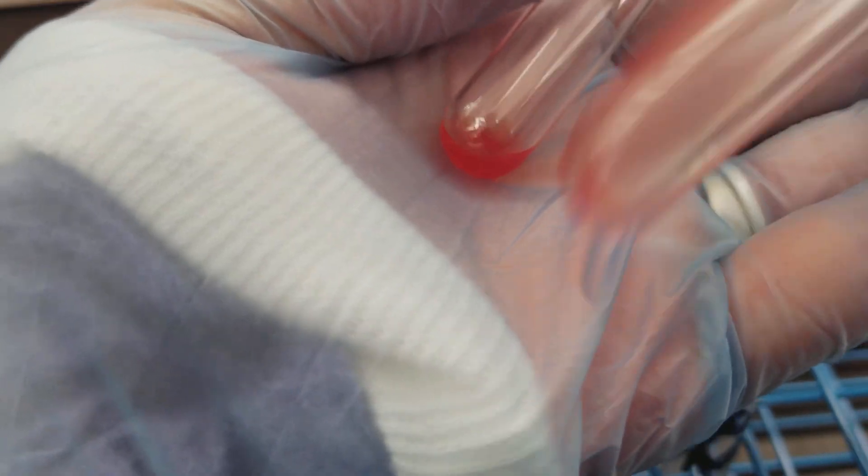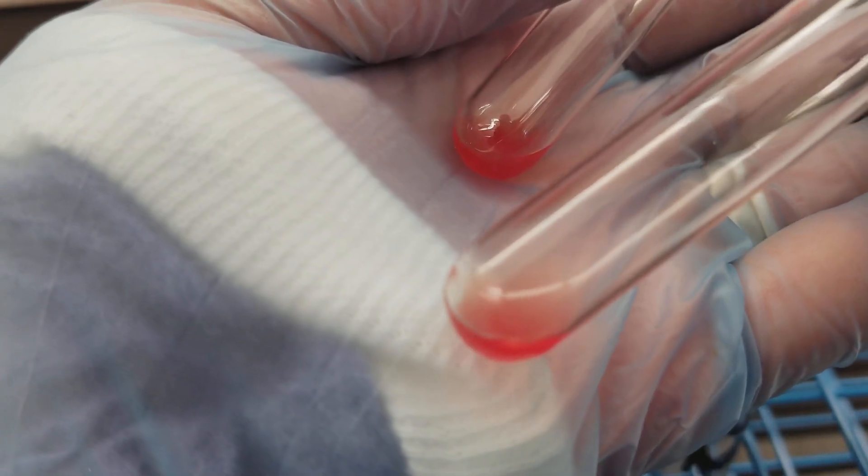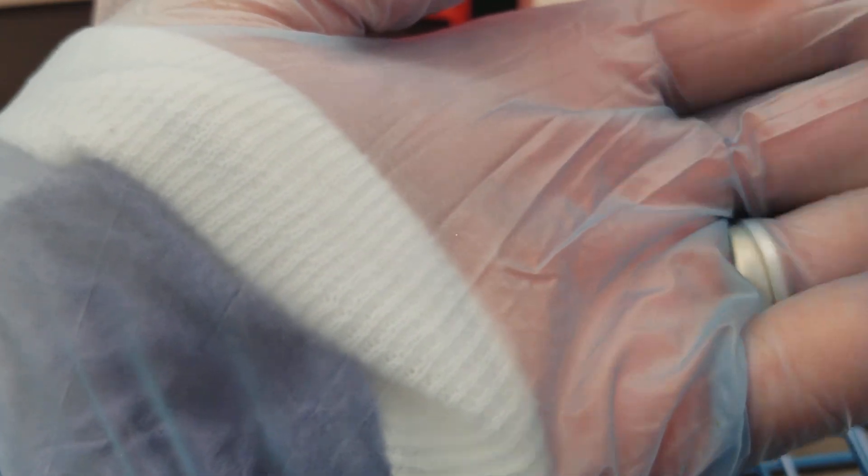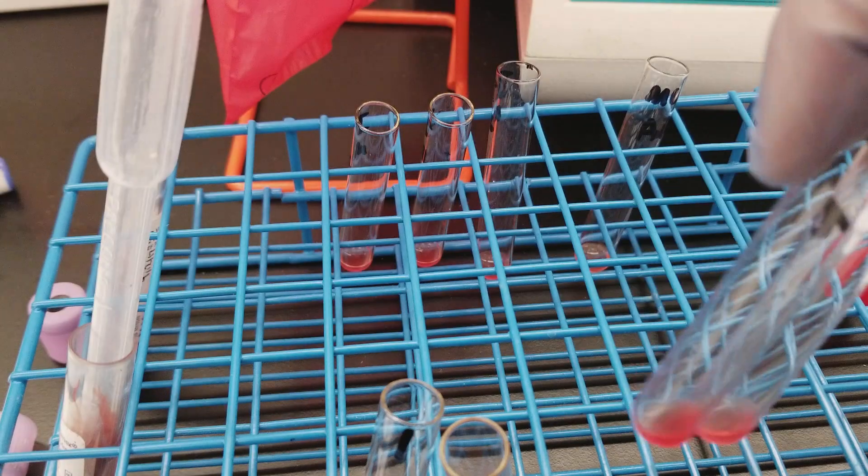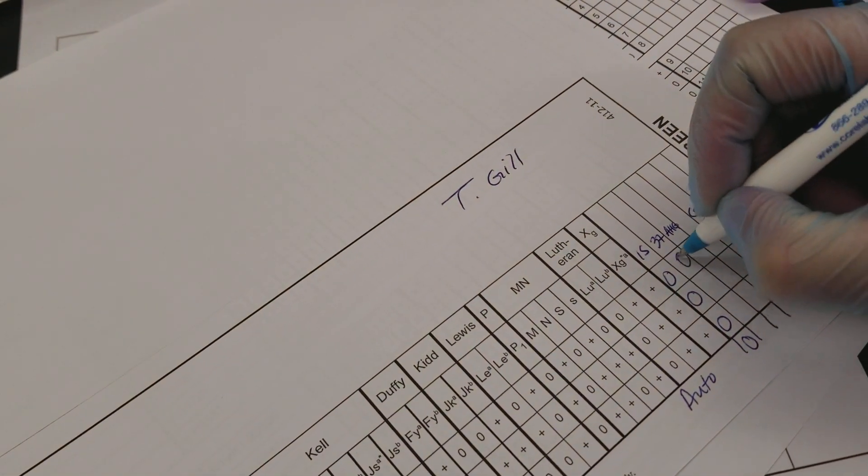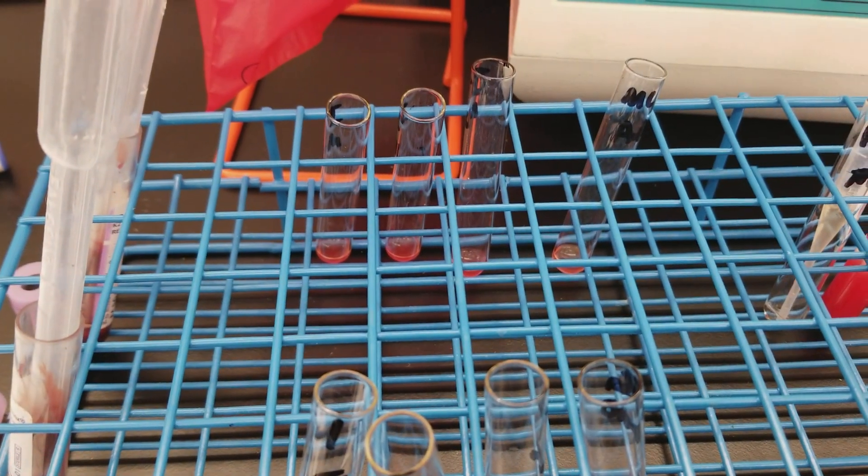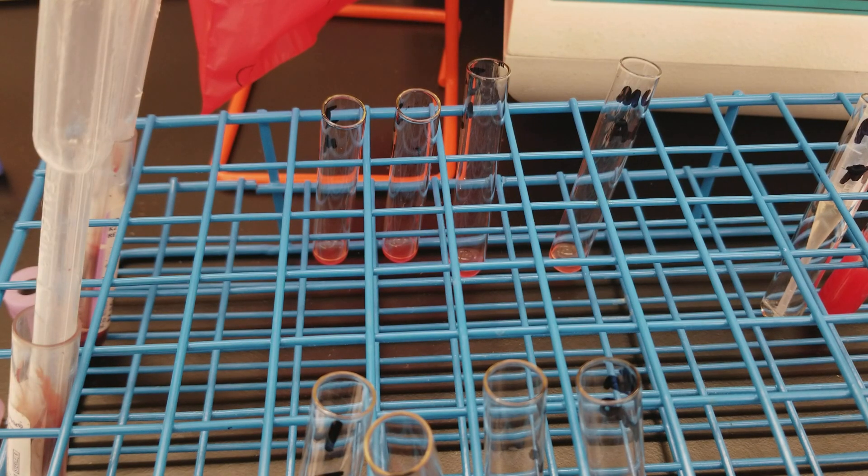These are cells one and two, so they're still negative. This is cell three and the auto control, and those are negative. So this patient is still looking like they're negative. So now we're going to do the wash step.